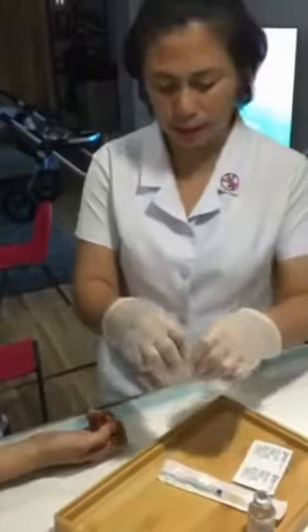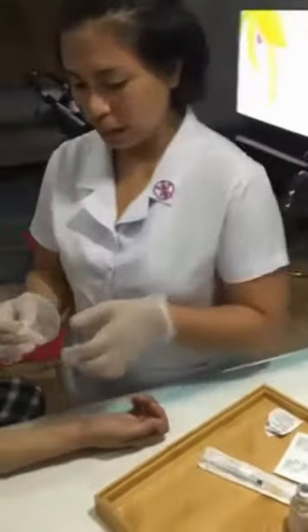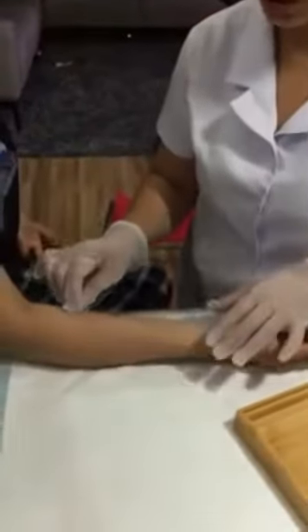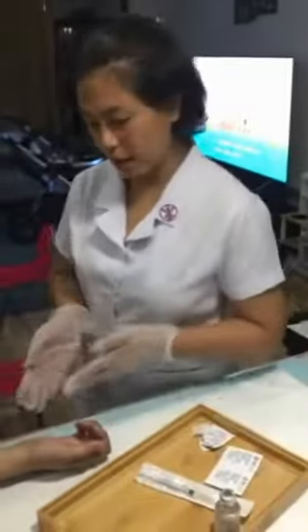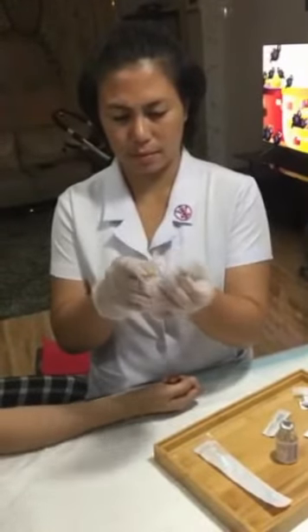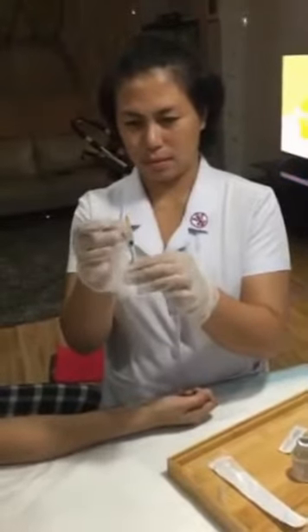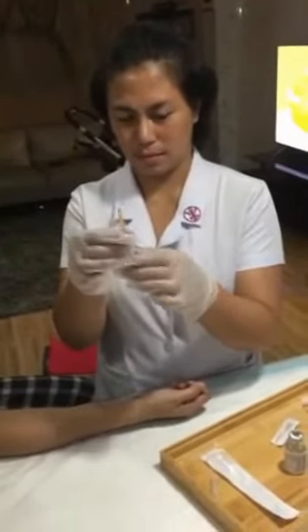Now I'll be cleaning the site with the antiseptic swab in a circular motion from inner to outer, and allow to dry to prevent irritation. Prepare the syringe for the injection. Remove the needle cap. While waiting for the antiseptic to dry, expel any air bubbles from the syringe.